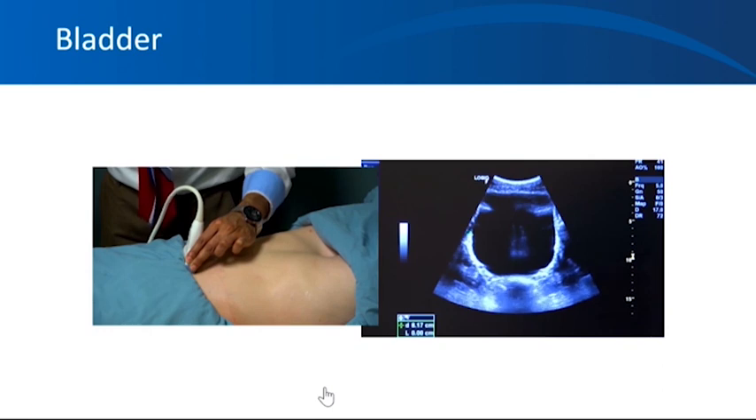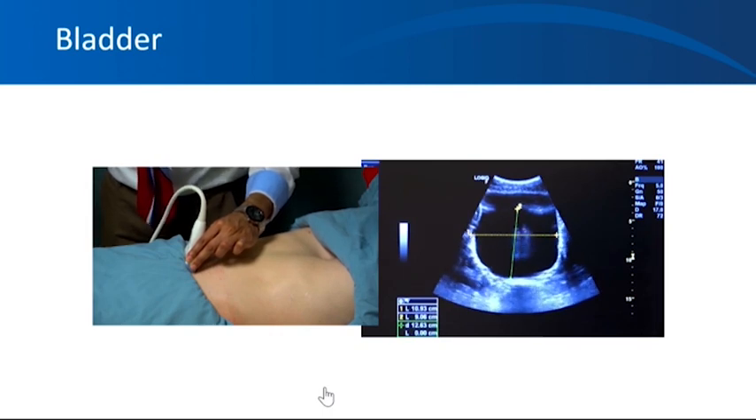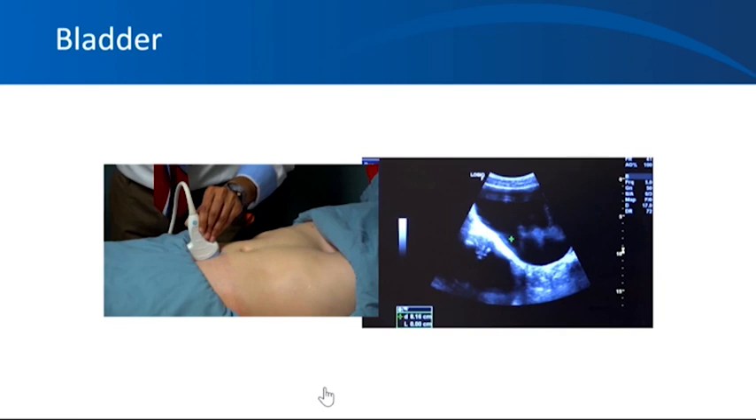Once you find the bladder, take measurements to calculate bladder volume. In the transverse plane, freeze the image and measure the side-to-side diameter and the antero-posterior diameter — here you get approximately 11 cm and 9 cm. Then get the length of the bladder in the sagittal direction for a third dimension. The formula used to estimate bladder volume is the ellipsoid volume formula: length multiplied by width multiplied by height multiplied by 0.52. You can also simply multiply the three readings and divide by two for a similar result. In our patient, the bladder volume is approximately 650 cc based on these measurements.